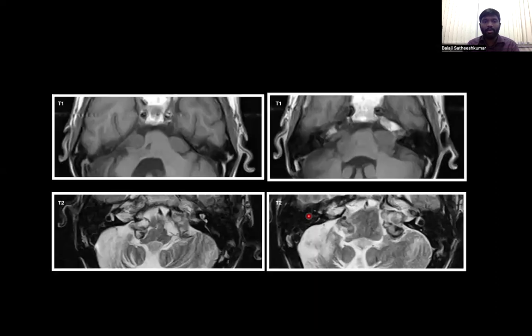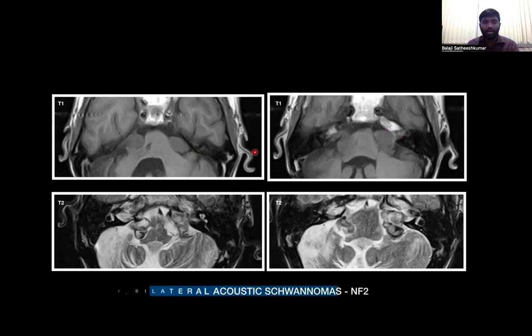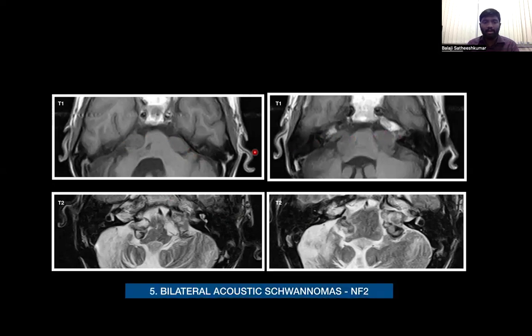Moving on to the next case, here we see a well-defined extra-axial lesion in bilateral cerebellopontine regions extending into the internal acoustic meatus, which is suggestive of bilateral acoustic schwannomas in a case of neurofibromatosis 2.